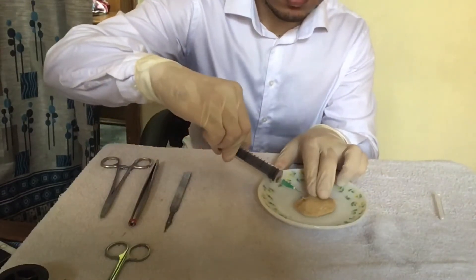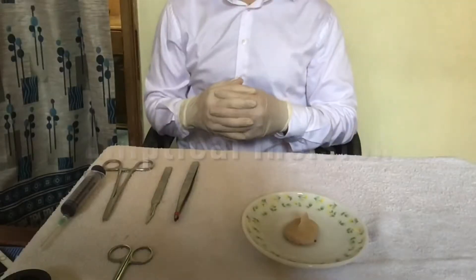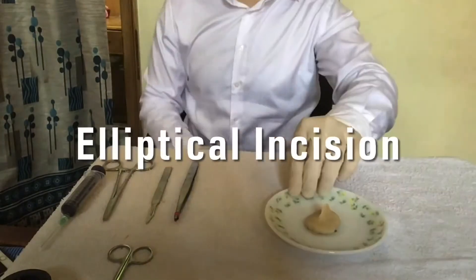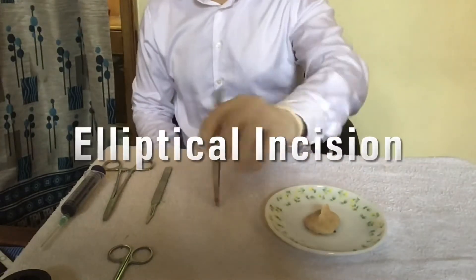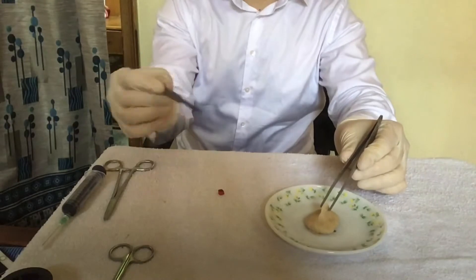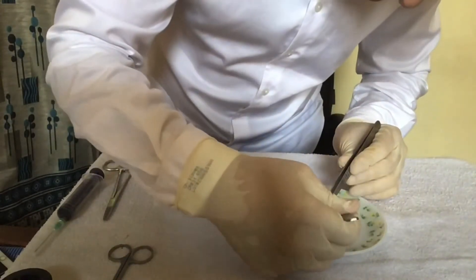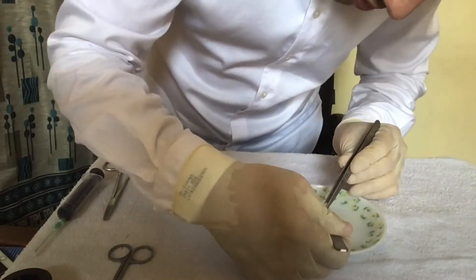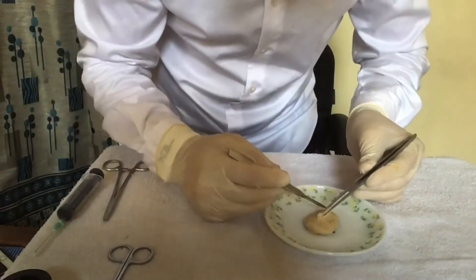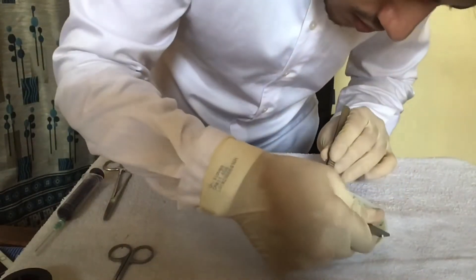For elliptical incision, examine the skin tag and hold it with a tissue forceps. Now hold the blade 10 scalpel in a pencil grip and start dissecting subcutaneously, making sure the area comes into the same plane.